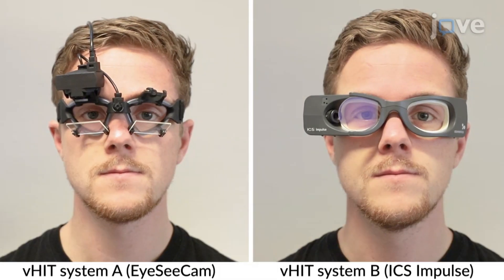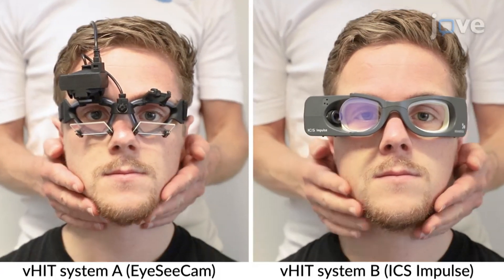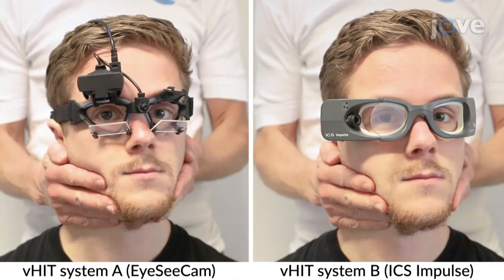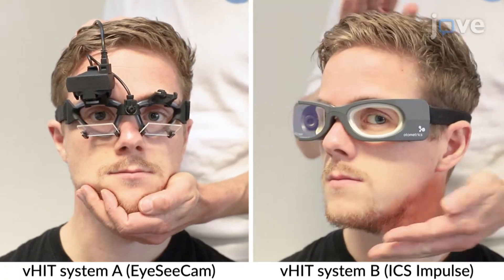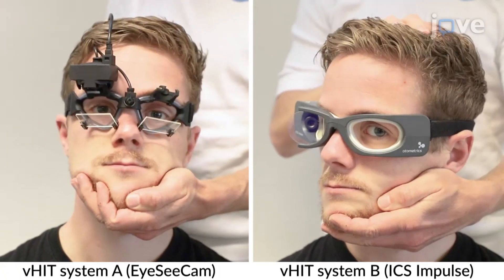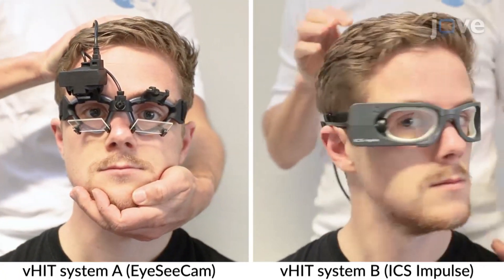VHIT systems used for demonstration in this video include the EyeSeeCam system, which will be referred to as VHIT system A, and the ICS impulse system, which will be referred to as VHIT system B throughout this video.